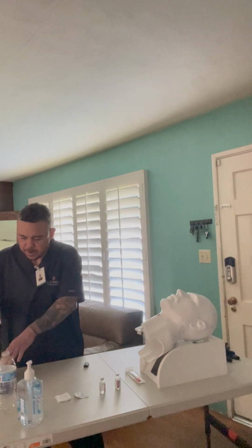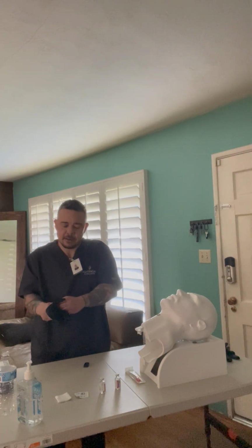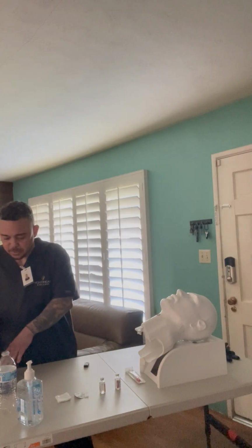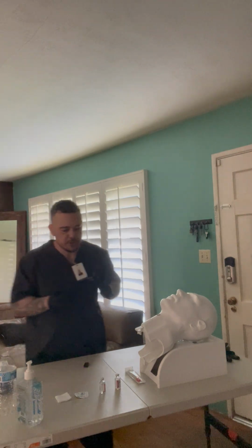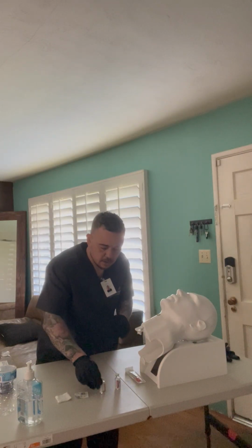First I'm going to use hand hygiene, hand sanitizer, and then my gloves. I'm going to go ahead and put some gloves on. Okay. All right.